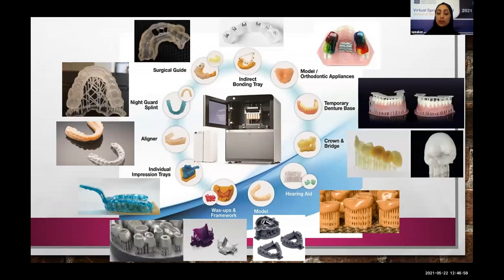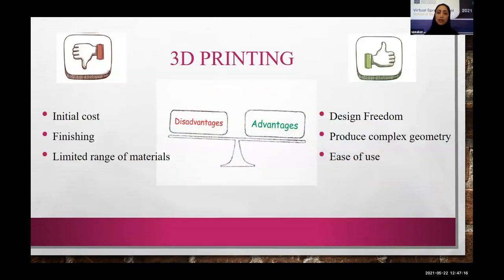has several applications in dentistry, like crown and bridge, denture bases, orthodontic appliances, indirect bonding trays, surgical guides, night guards, aligners, special trays, wax-up and frameworks, dental models, and even, moreover, hearing aids. As with any other technology, 3D printing has its own advantages and disadvantages.